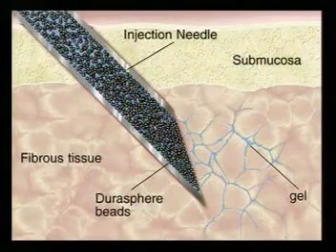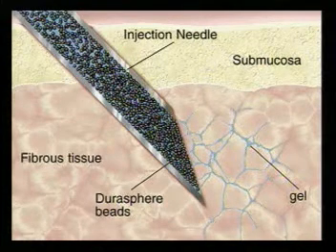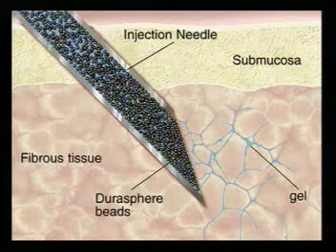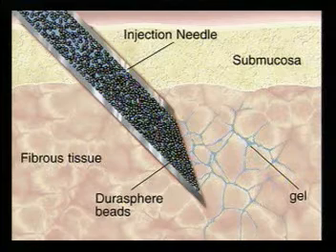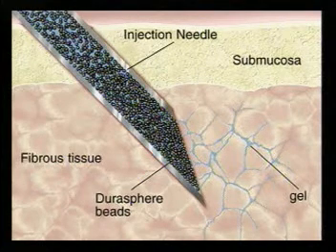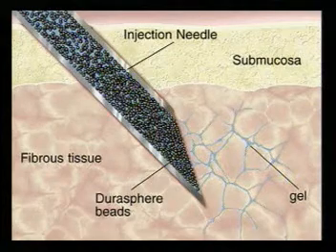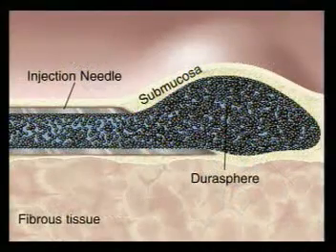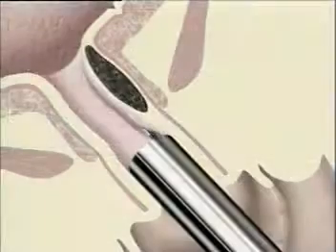When the needle tip is not placed correctly, Durasphere injected into fibrous tissue prevents the flow of beads. The fibrous tissue acts as a sieve, allowing the carrier gel to flow without the beads. This can cause significant resistance and can result in clogging the needle. Resistance is an indicator of incorrect needle placement. Should this occur, reposition the needle into the submucosal tissue prior to continuing injection.